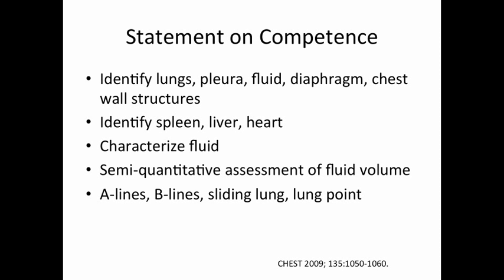You can also assess the fluid semi-quantitatively. I didn't include that here in the interest of time, but we went over it in the grand rounds that I gave a couple weeks ago. And then some of the specific findings which you should know include A lines, B lines, sliding lung, and lung point, which we'll go over.